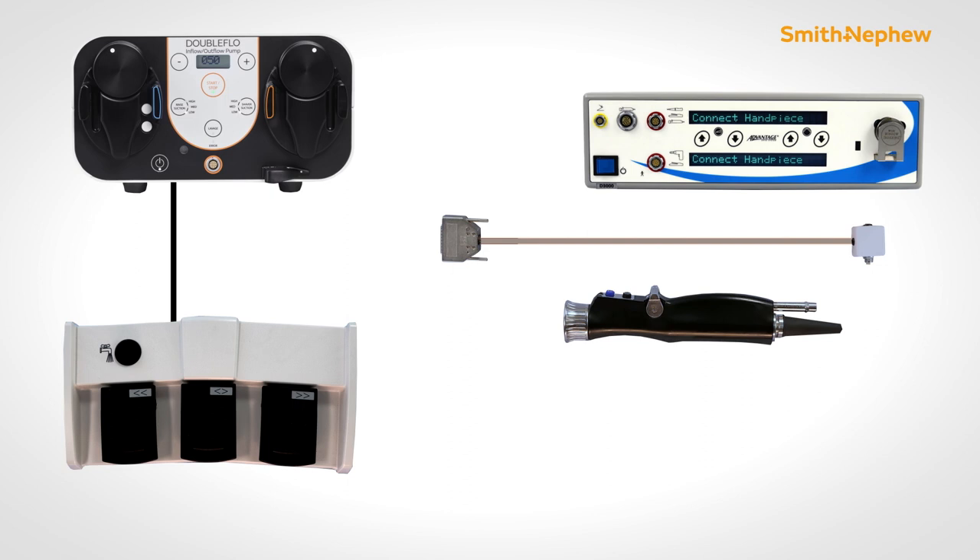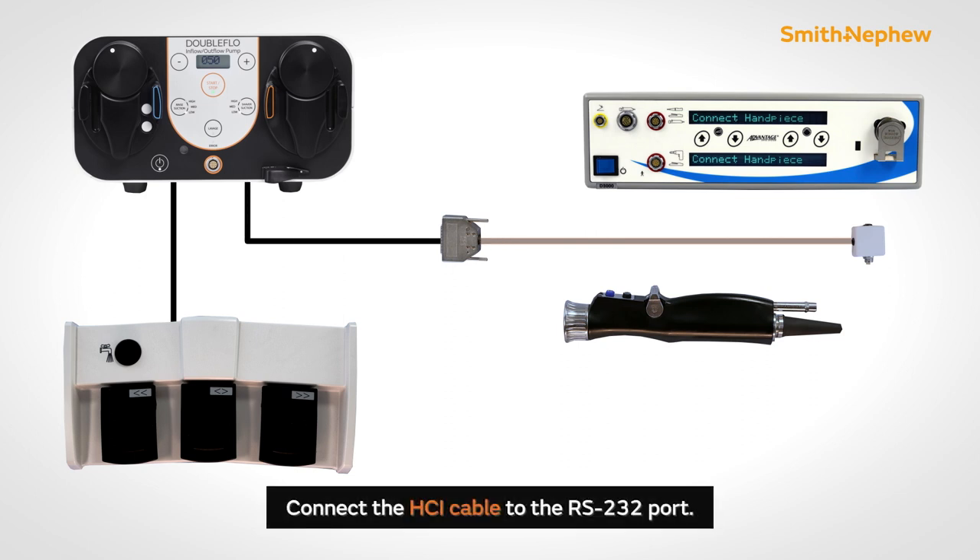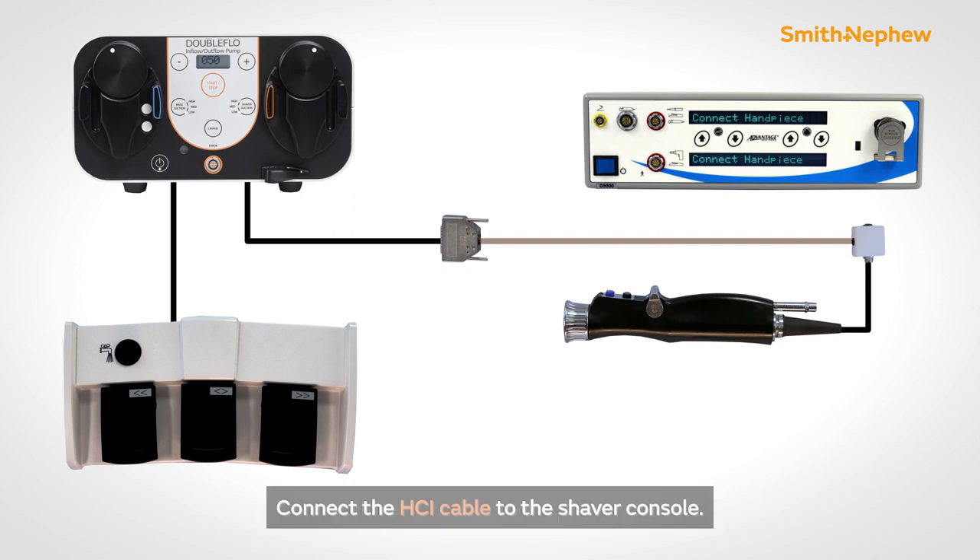The DoubleFlow pump offers compatibility with competitive shavers via the hand control interface. Before plugging or unplugging the HCI, turn off the pump and shaver consoles. Connect the HCI cable 25-pin connector to the 25-pin receptacle on the back of the pump. Connect the shaver handpiece to the circular receptacle on the HCI. Connect the HCI cable to the shaver console.